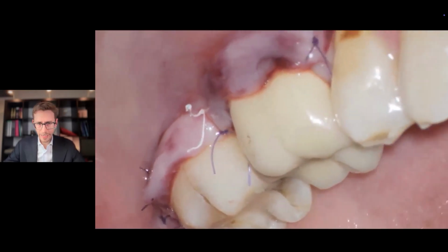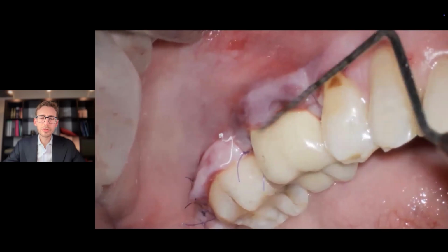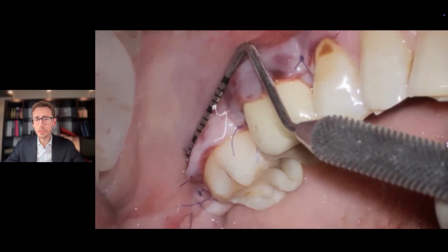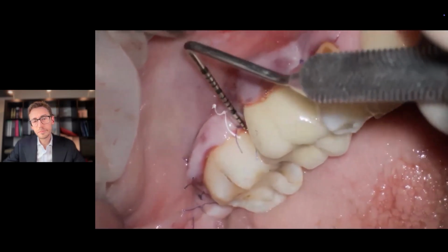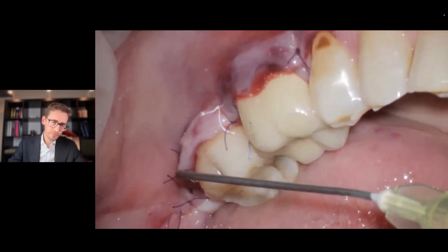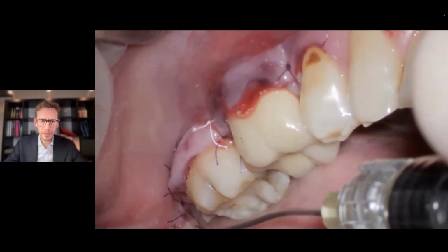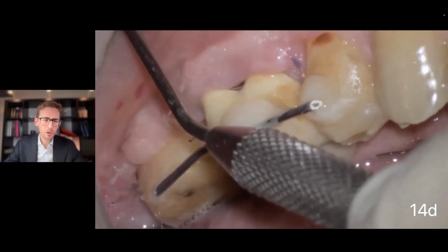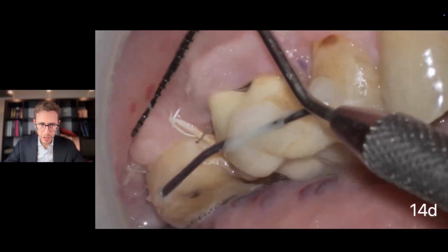And once again, exactly as we have performed in the previous surgical interventions, you see the watertight first intention wound closure, which is followed by the application of the third layer. It is very important to check once and once again that no blood is coming out of the sulcus at the end of the surgery to make sure that true watertight first intention wound closure has been achieved.